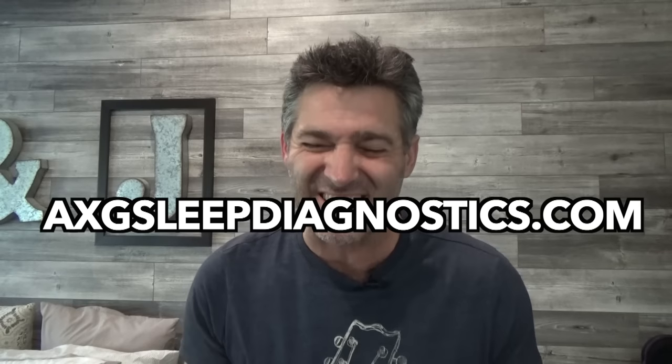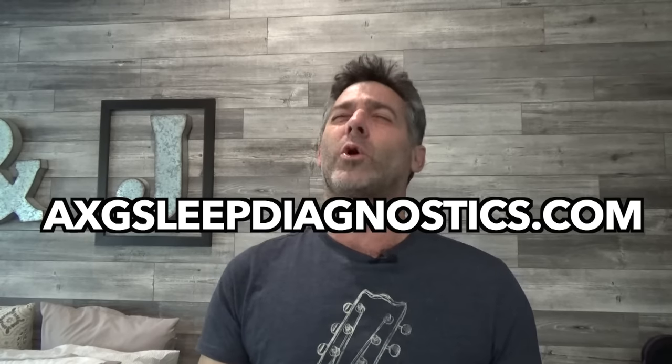If we're using a nasal mask, let's go ahead and use the Brevita because I have it readily available. Now, if my mouth is closed and I'm just breathing, I have air venting out of this hole right here. All's good, right? However, one of the biggest problems I see when I'm doing my PAP therapy analysis at AXG Sleep Diagnostics, always find a way to work it in. Boom! If your mouth is closed, you have a closed circuit.